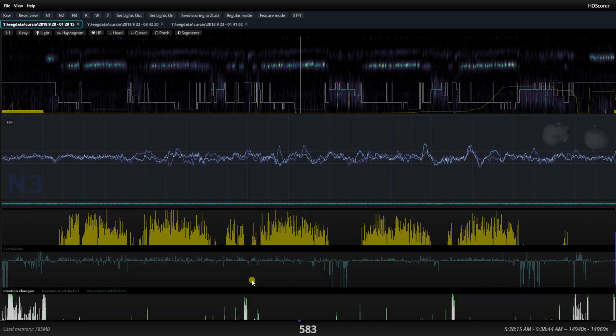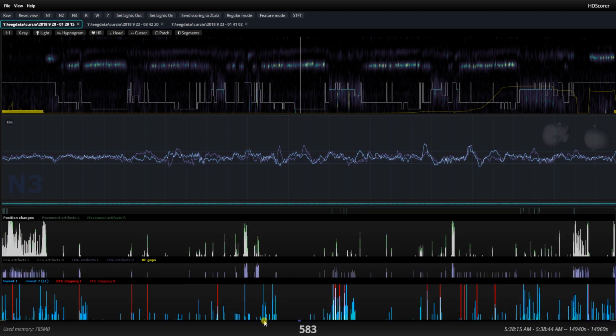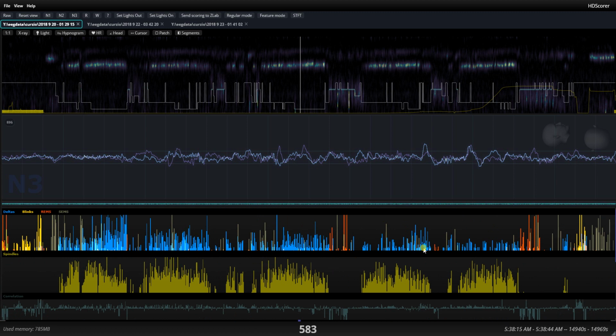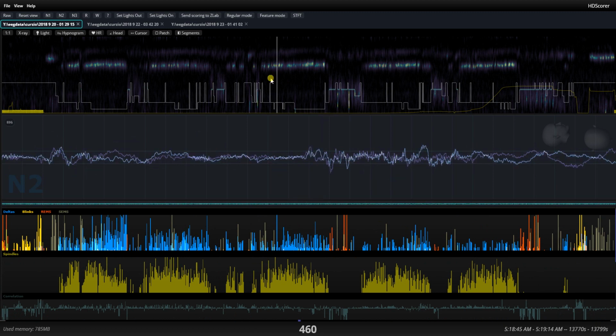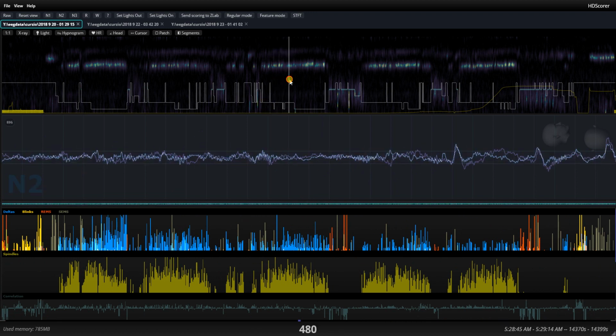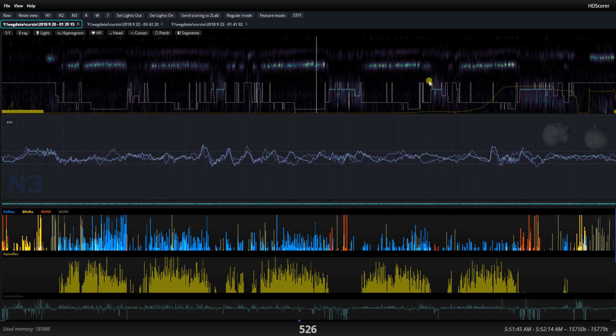You might be interested in the correlation of the signal, or in the amount of movement, or in the amount of sweat. These are all things that you could operate directly on, even without resorting to a hypnogram, which is basically a reduction in dimensionality from these and many more features that are detected by Zmax, and then transformed into just an integer number from 1 to 5 with the sleep phases. So you have a lot more information here, and it's available in text format as well, so you can do whatever processing you like to do on it.